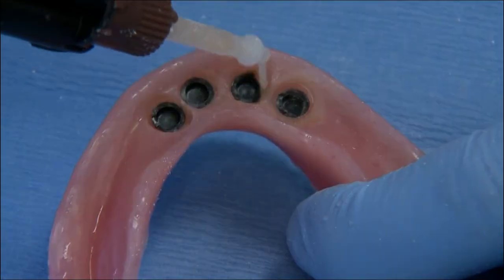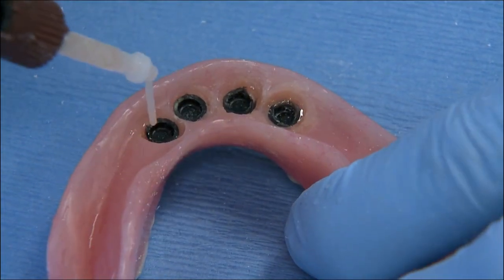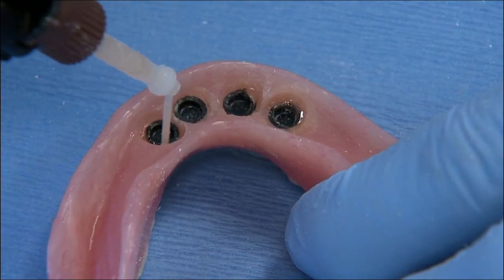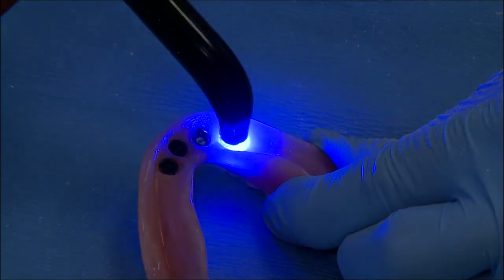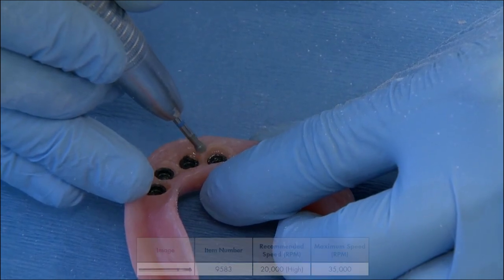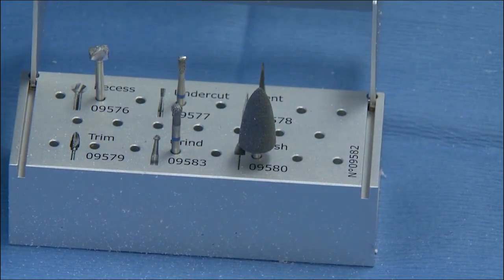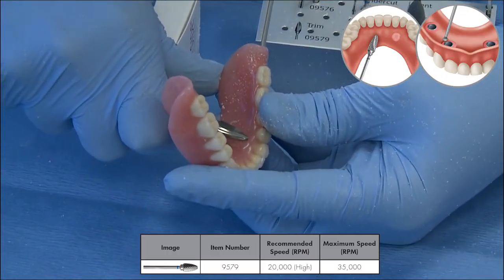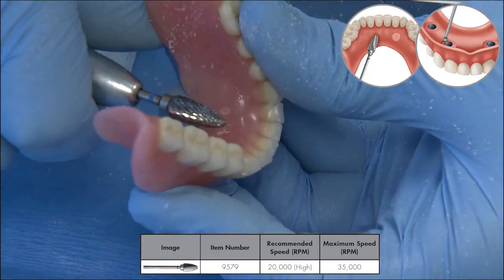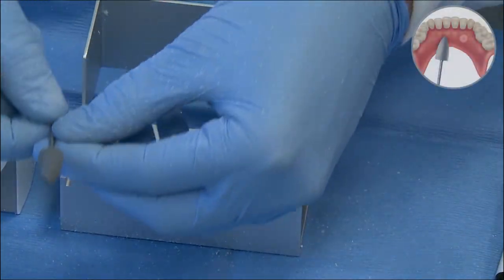At this point, I can use the chairside attachment processing material with the angled tip to fill in any voids within the areas around the locator denture cap. Once I've applied this material, I accelerate the set with a light cure unit, approximately 20 seconds per attachment. Immediately after light curing, I go back to the grind burr and adjust the areas around the denture caps. Once satisfied with the appearance of the intaglio surface around the denture caps, I take out the trim burr, used at high speed principally on the cameo or outside surface of the complete denture. It's perfectly suited to trim the areas around the vent holes created through the lingual or palatal slope of the denture.